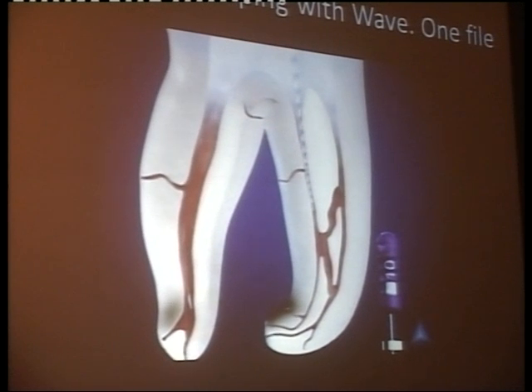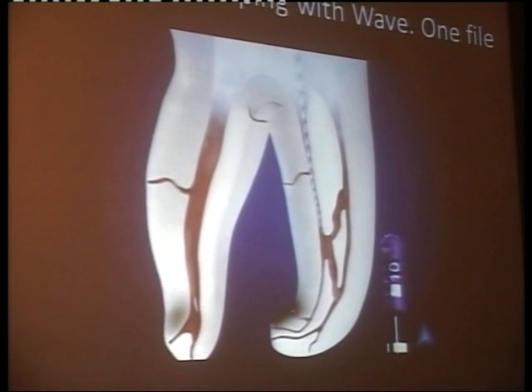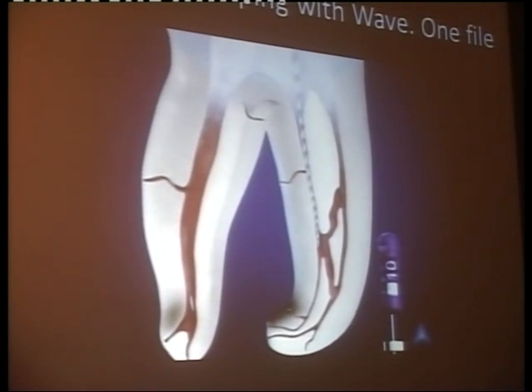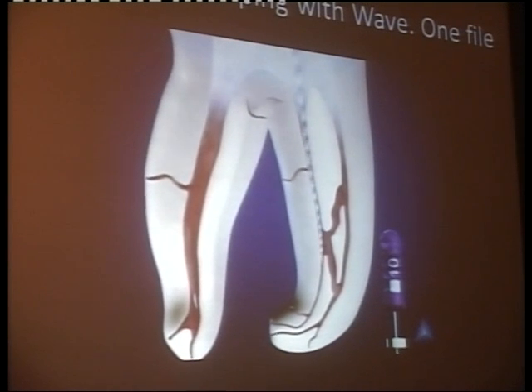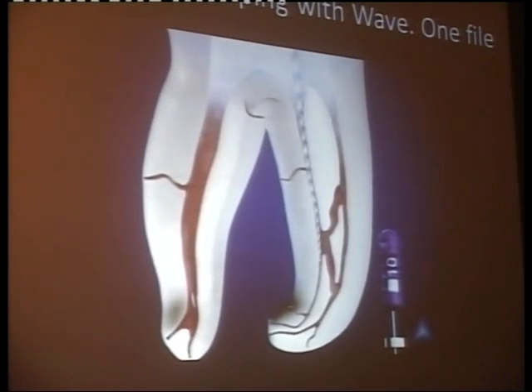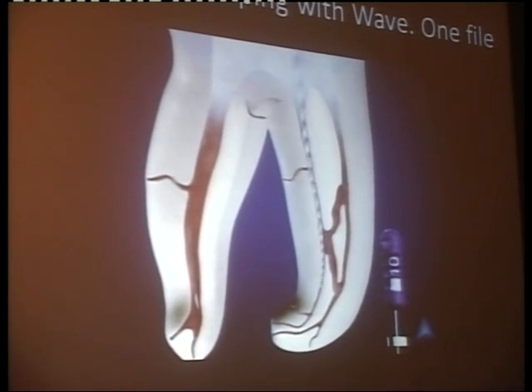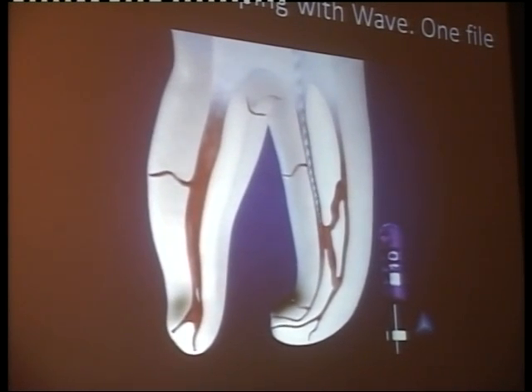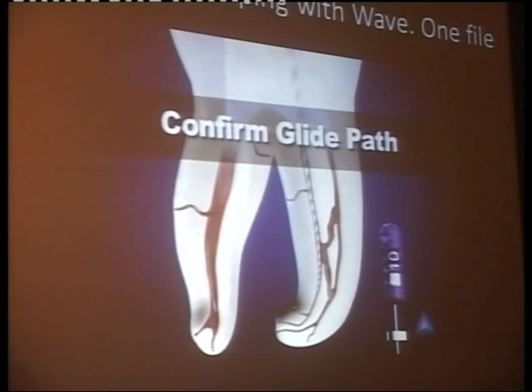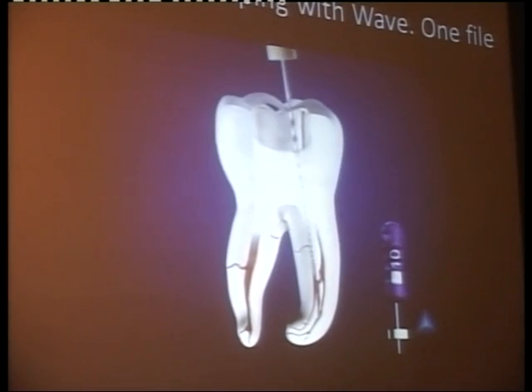You cannot prepare this type of canal, never. That is an interconnecting canal. You have to clean it, just clean. And you must fill it with thermoplasticized gutta percha. Without that, the gutta percha will not enter into this. And then the space will be an empty space, and there is a chance of connection with the external surface of the tooth, and there is a chance of reinfection of the canal. Then negotiation is done.